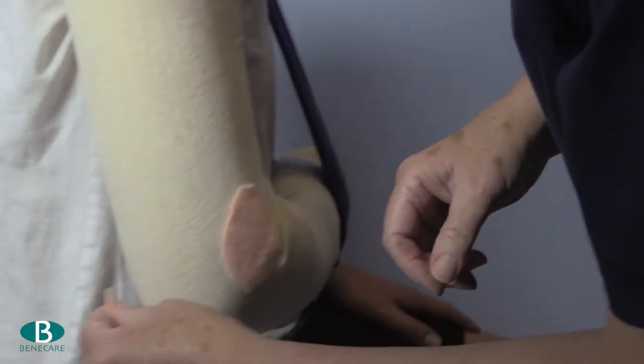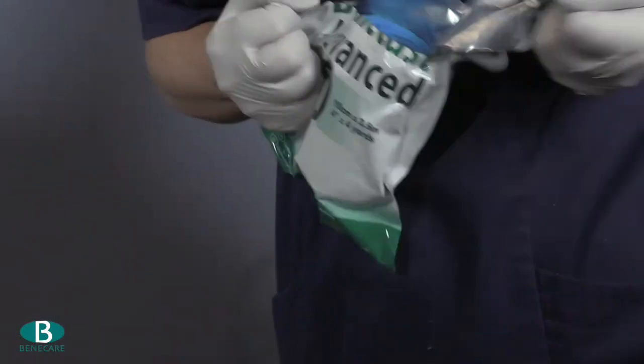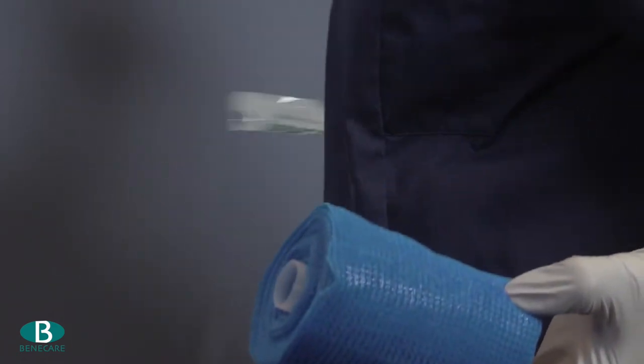I will now apply two small pieces of fleecy web directly onto the epicondyles of the humerus. If felt was being used I would use a negative padding approach.